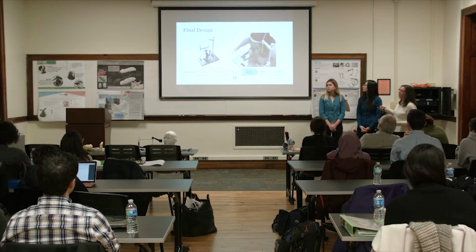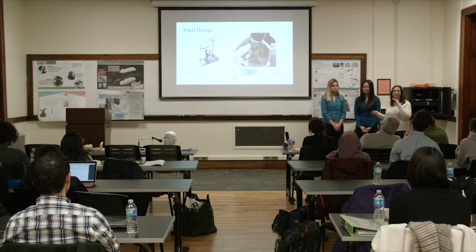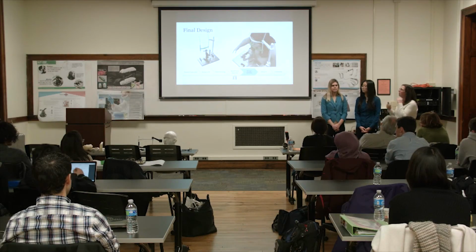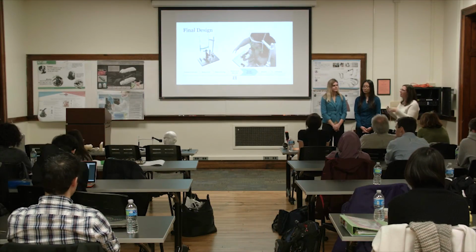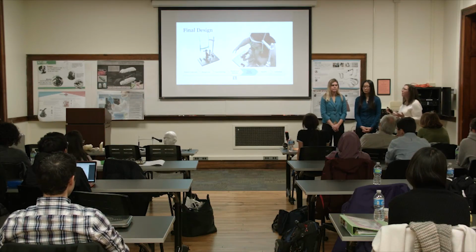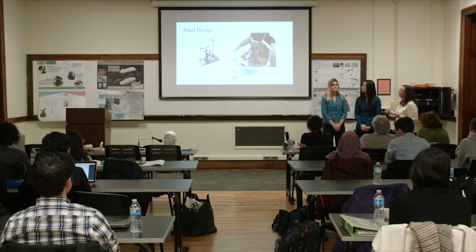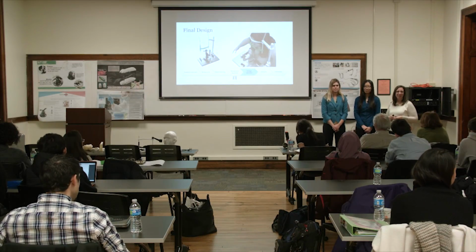Our chin rest, I don't think we have any pictures of it closer up. This is the best. We have several iterations of it. We made it more sculptural, and it fits the chin a lot better. If you wanted to try it out, we have several. The first iteration was shorter, basically the same size as what is currently available. But after testing it out, I extended it a little bit and made the lip that comes up a little bit higher. It's only a couple of millimeters of difference, but it makes a huge difference. That's one of the benefits of using Fusion 360 for this project: we used Sculpt for the chin rest because it made it very simple. To me, it's a little bit more ergonomic. I would rather have my chin rest than what I currently get at the optometrist.